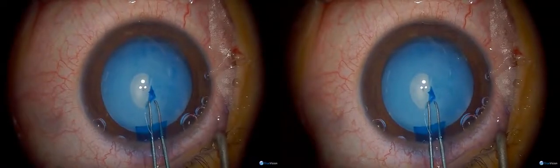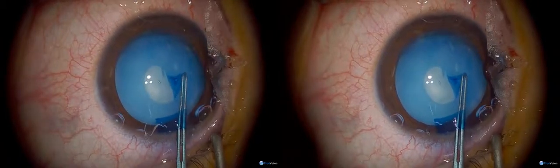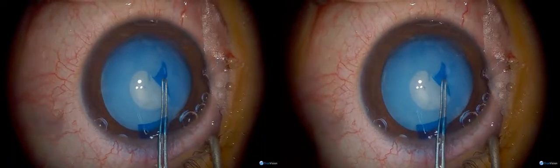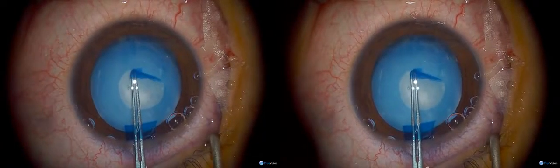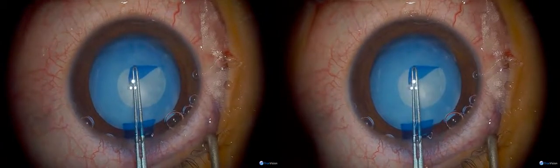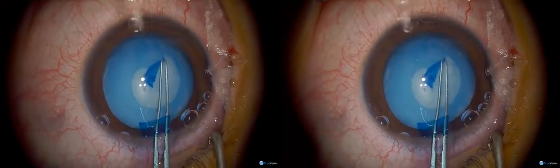This is a young man with a mature cataract. We don't know why — he's not atopic as far as we know, and he's never had steroids. So you have to be a bit careful not to go too wide with the capsular rhexis. I tend to try and spiral it outwards like this — it's going very slowly.